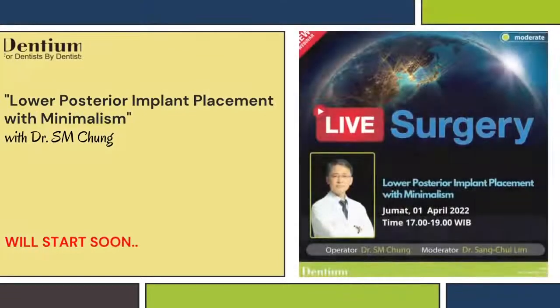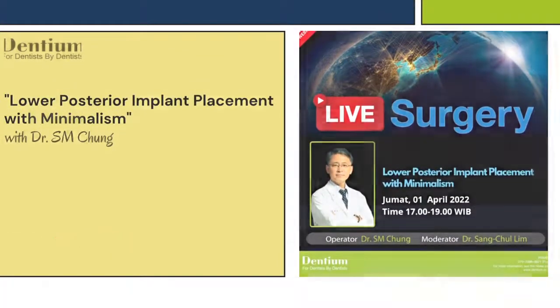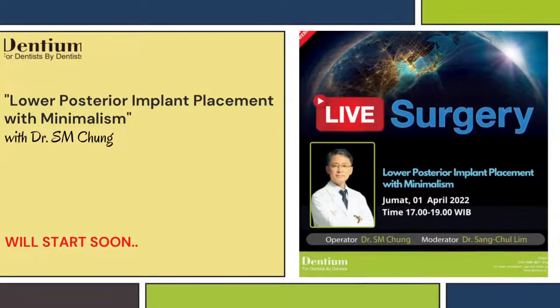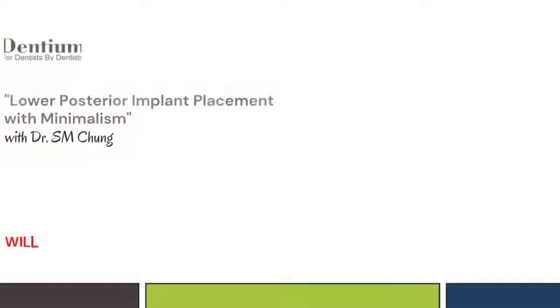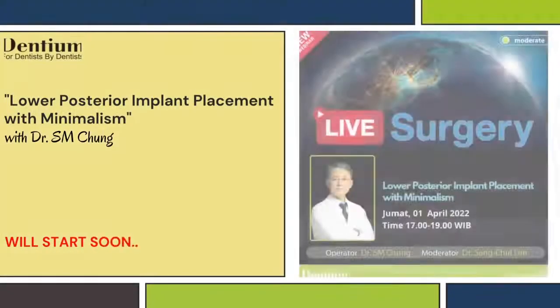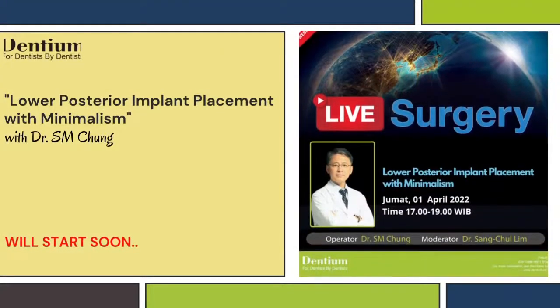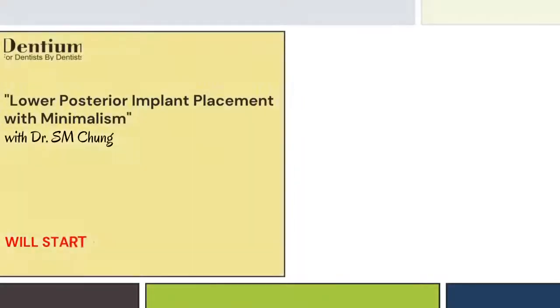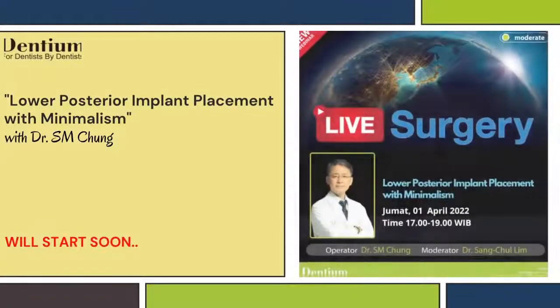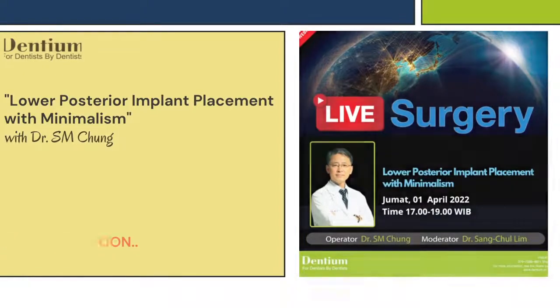For today, our live surgery will be implant placement with the minimalism concept on the lower posterior region. Our operator today is Dr. Chung. These procedures will be introduced with flapless surgery and Bright tissue-level implant fixtures. I hope this surgery helps you in developing your treatment concepts. Thank you. Well, let's take a look at today's case.